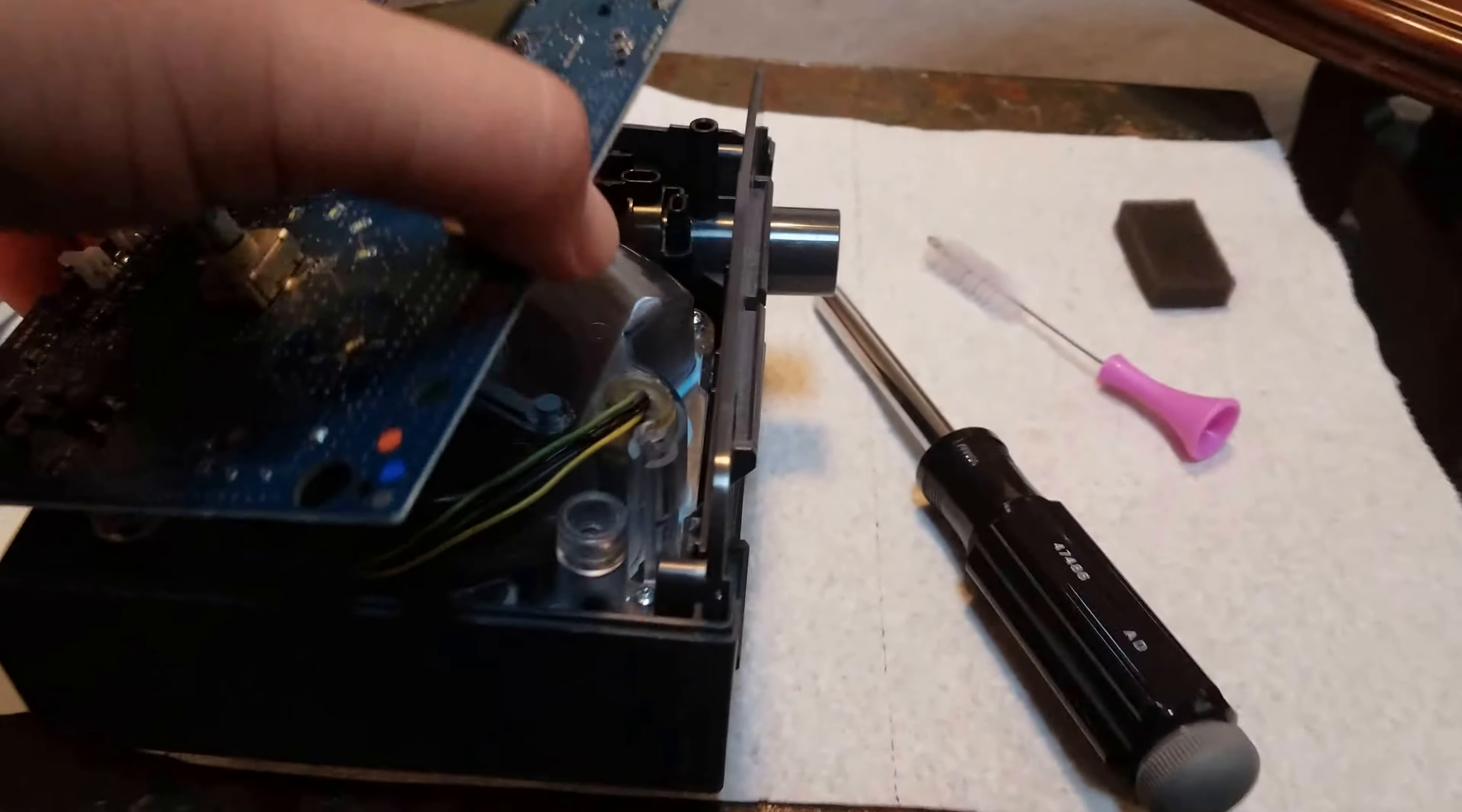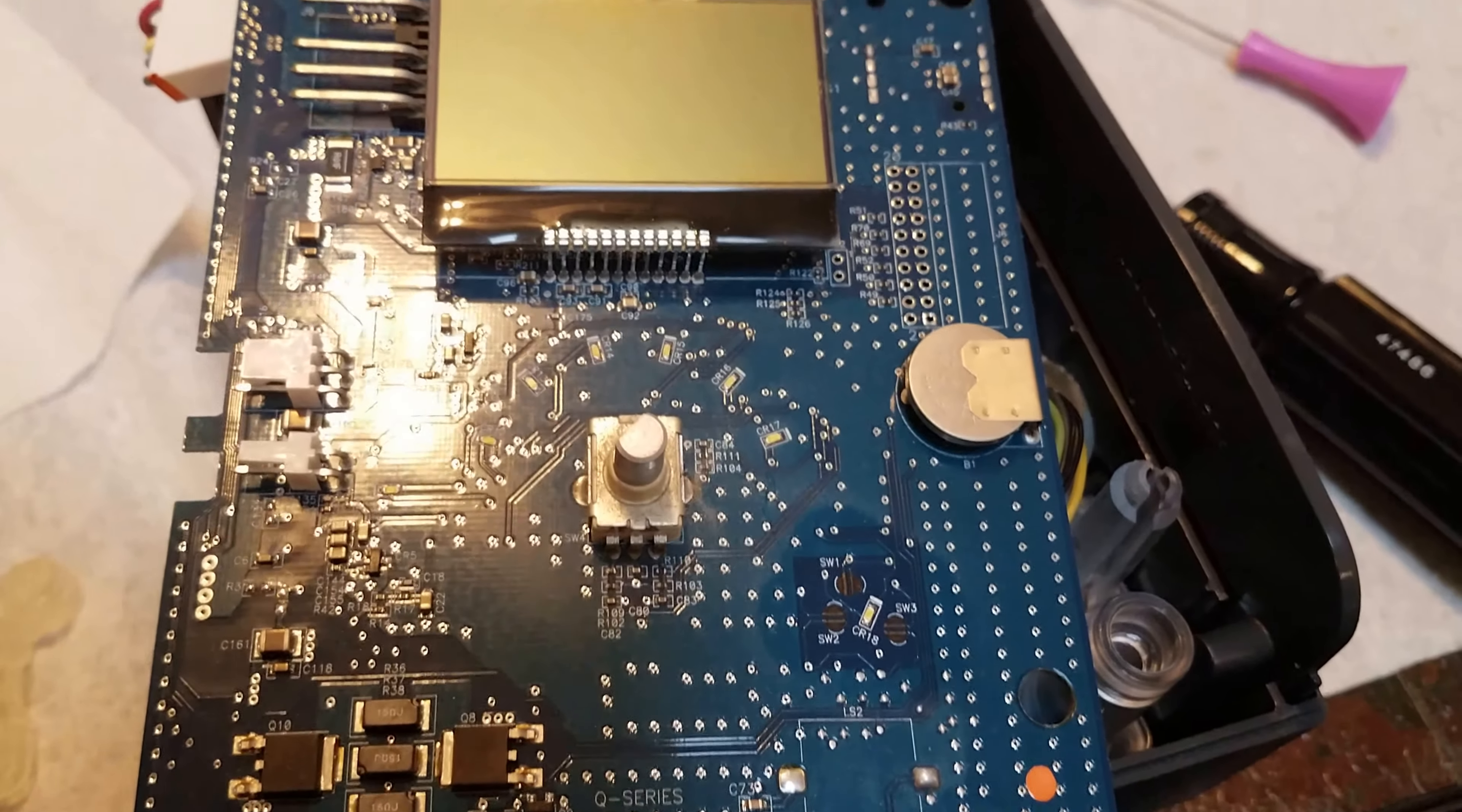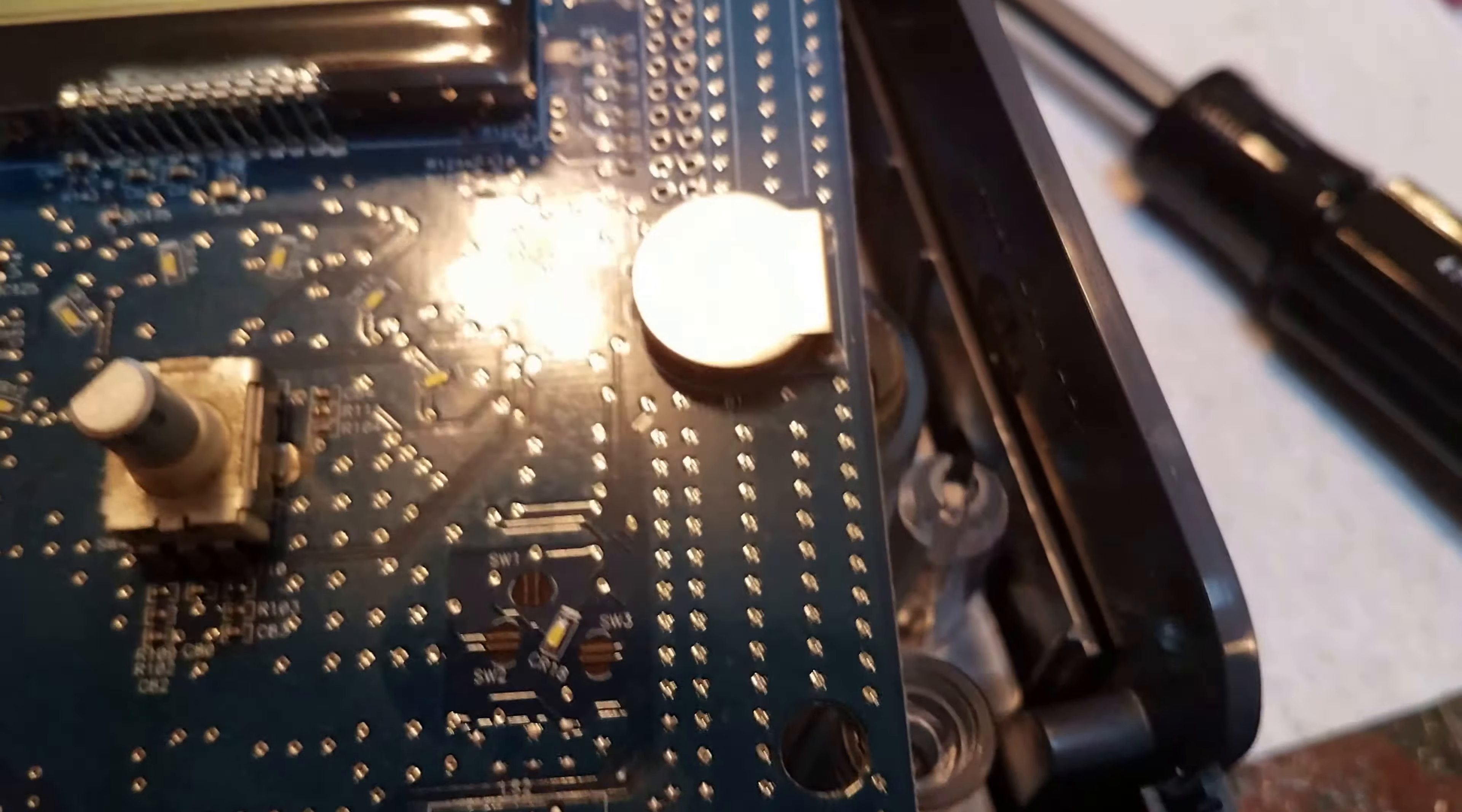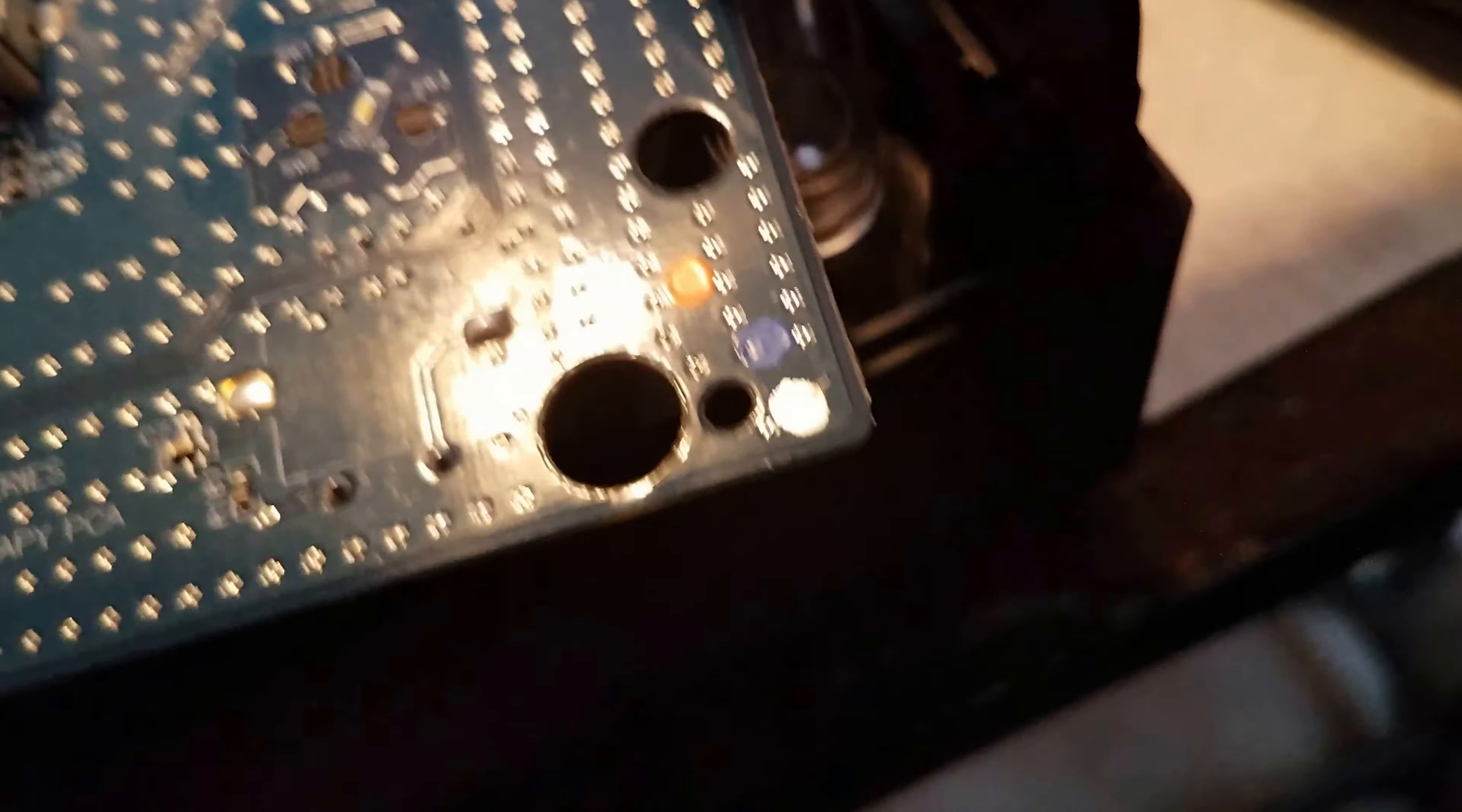Now one thing I didn't show you before was this circuit board. If you get a lot of dust or something like that, you may want to take some dust blaster or pressurized gas and just dust it off. There is a lithium-ion battery there, so if your system is not holding your information, this may be the reason why.